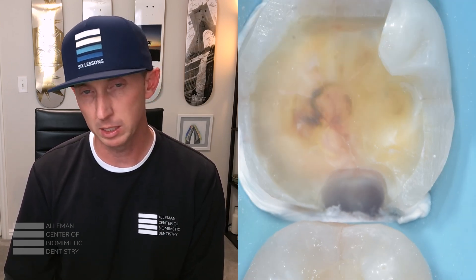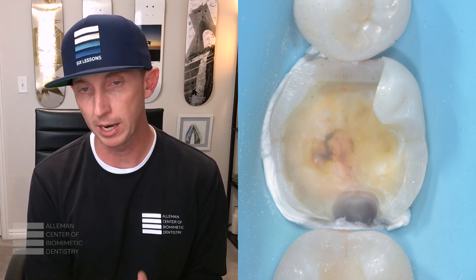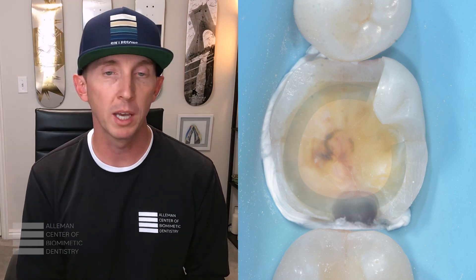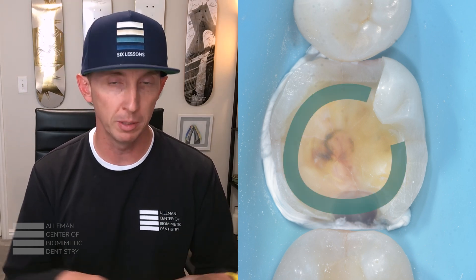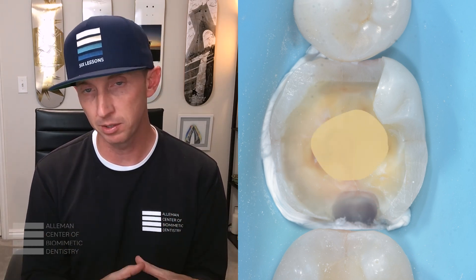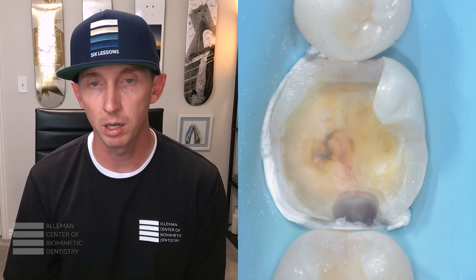At specific depths in what we call the central stop zone, we will stop and leave any of those fractures. The strength will be coming from the perimeter, not from the center. This is the compression dome that Graham Millicich talks about.